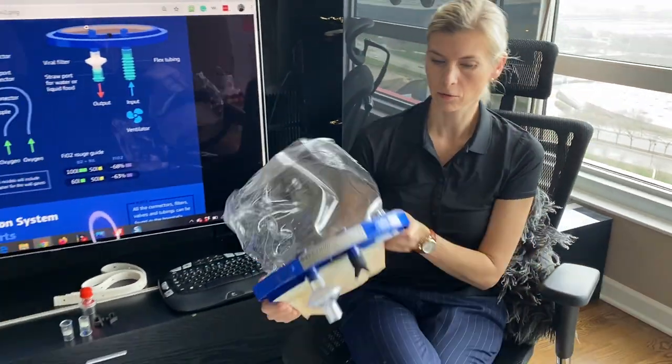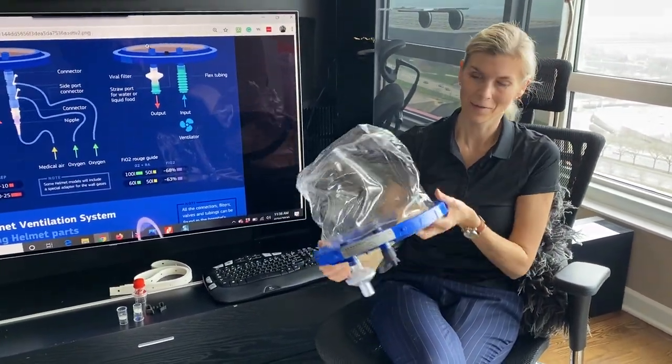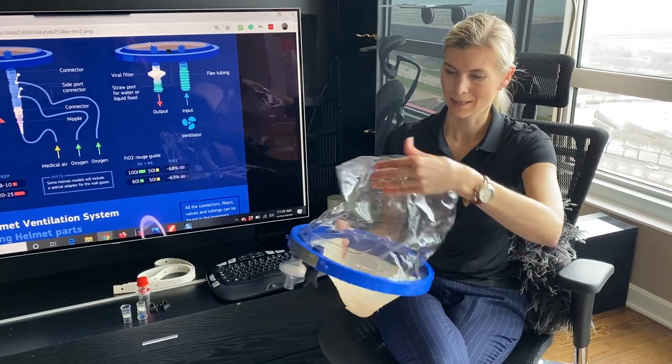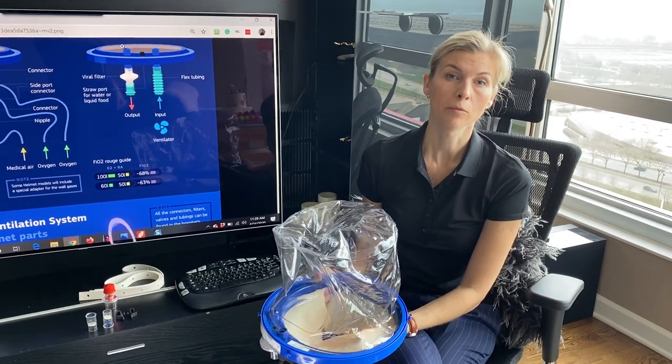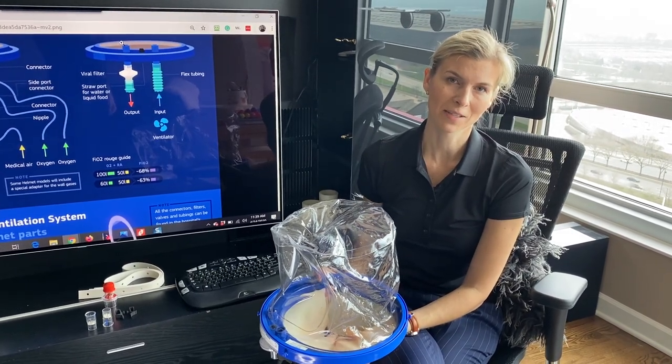C-Long is one of the first companies to make the helmet, and this helmet was used in the University of Chicago research about helmet-based ventilation.